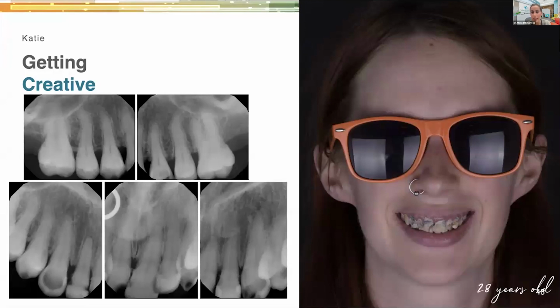And so fortunately, what we were able to do for Katie is actually print her crowns, single unit crowns for her entire maxillary arch with the notion, because again, I really like to underpromise, okay, we're going to just slowly convert each of these to porcelain, but I've got to get the decay out. I've got to stabilize you. I've got to make sure everything is nice and healthy. And Katie hasn't apparently broken enough to come back in to see me to start her porcelain work.